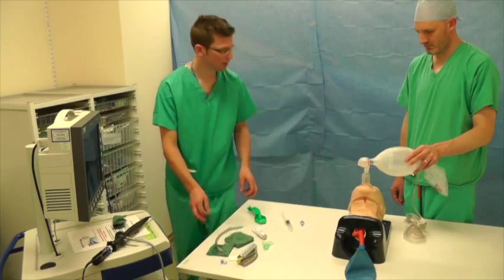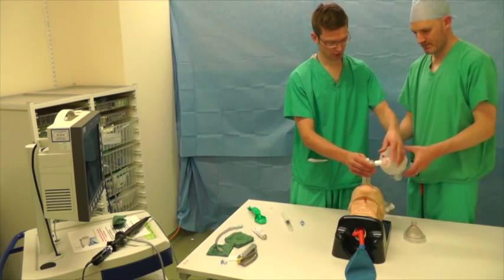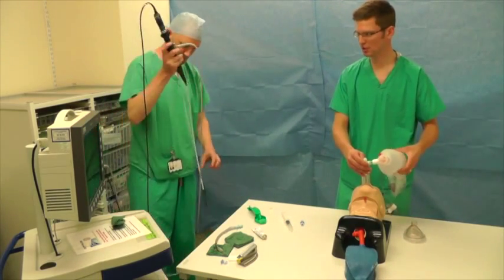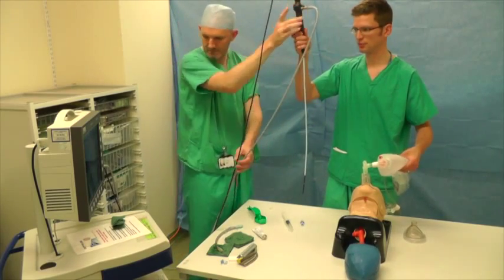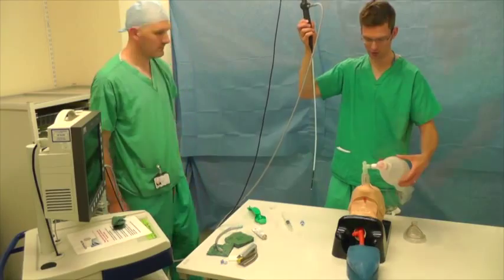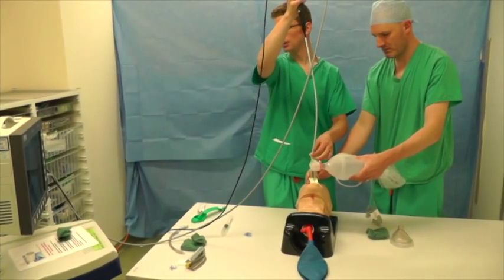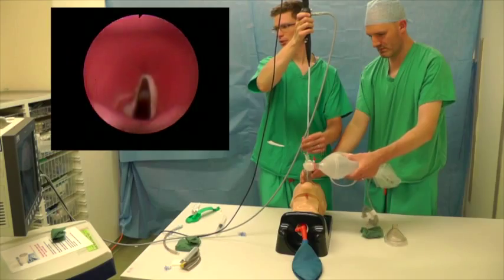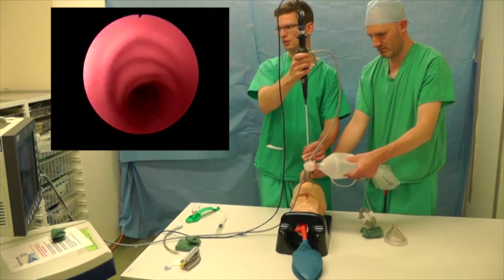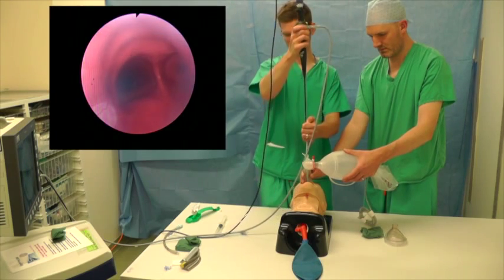Right, okay, I think we're ready, so I'll switch over to the top here. Can you just pass me the bronchoscope please? Just hit the one button at the bottom left of the screen — the white button at the bottom. Keep ventilating, that's great. Make sure I've got this — put the cord — that's it coming in.